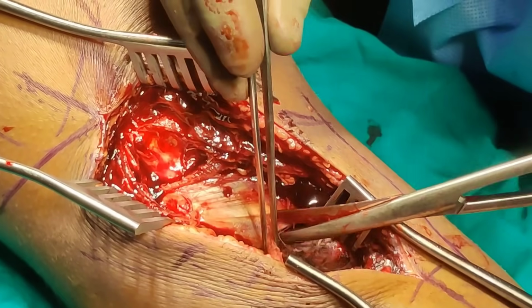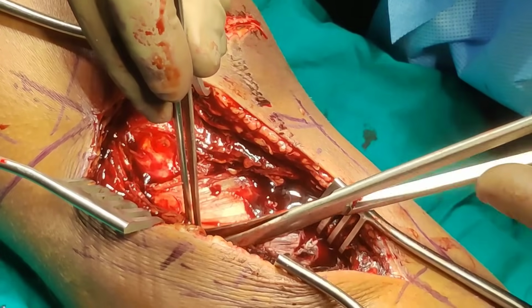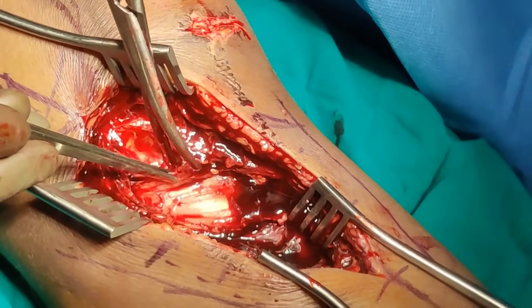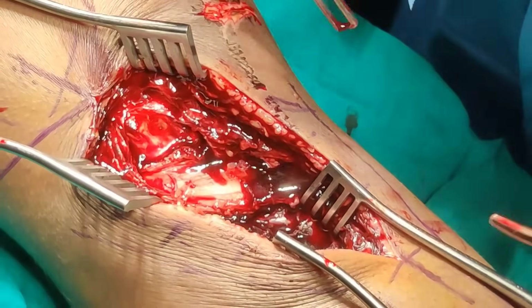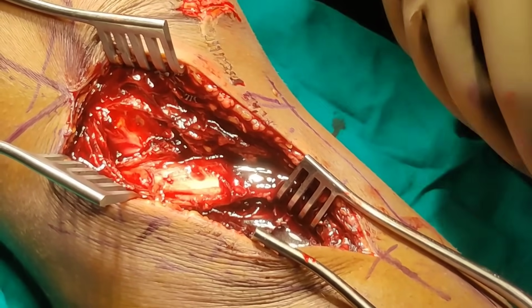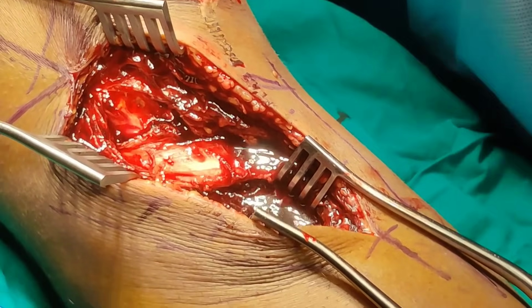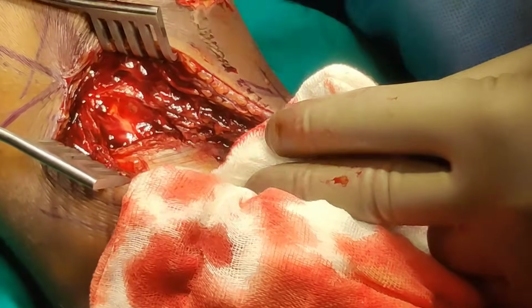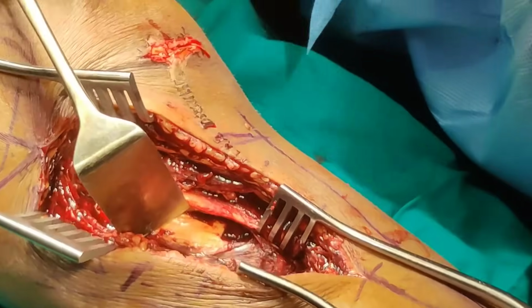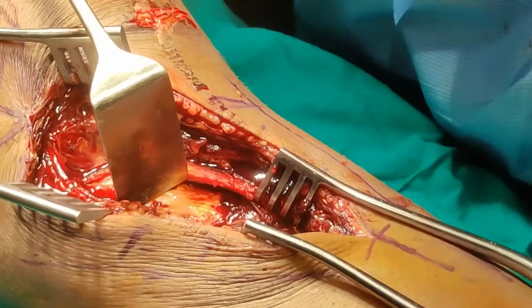So I've just opened the fascia just below the pes, and I'm just going in line the way you do when you are doing your ACL. So this is also just thin sartorius fascia. If I can have a Langenbeck please, let me see if I can mobilize my pes. So I'm not planning to skeletonize it. This is the usual. When I need a large Hohmann, they always give me the tiniest one, and when I need a tiny one, they will give me a big one. Anyways, we have it now. So you can mobilize the pes, and once you mobilize the pes, then you go onto the deeper layers.